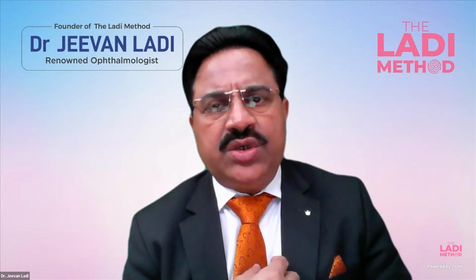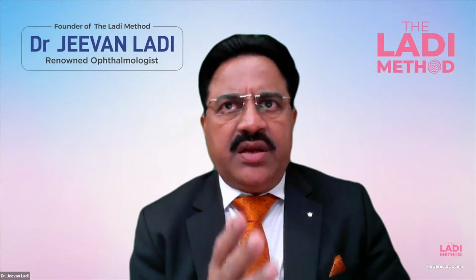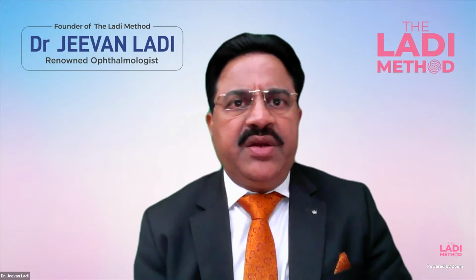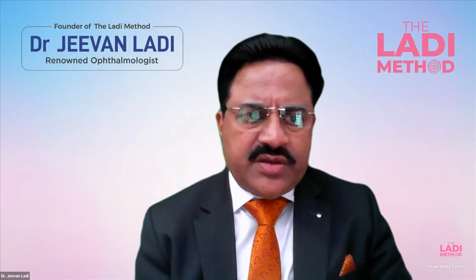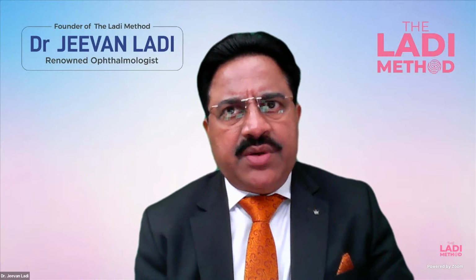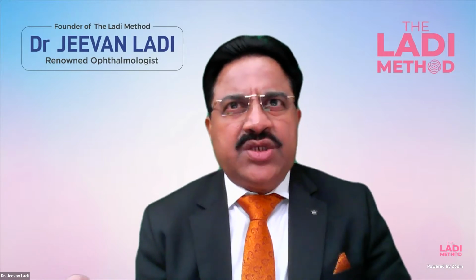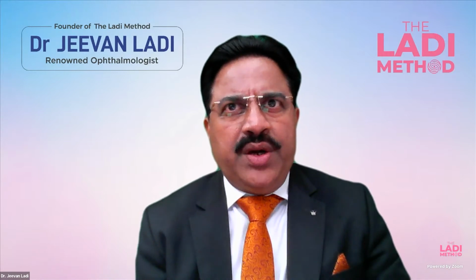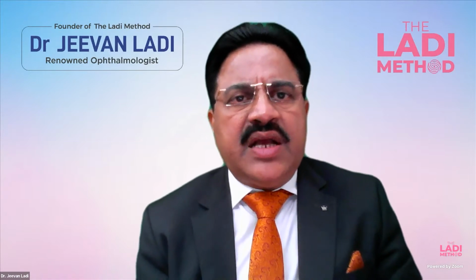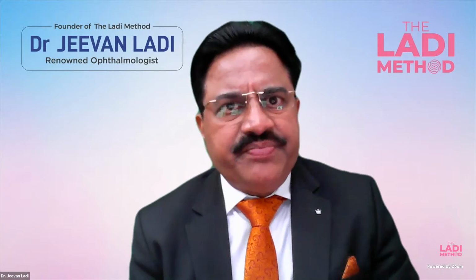The reason we are using topography is that it gives you more additional information, whether astigmatism is regular or not, and what else is happening to the anterior and posterior surface of the cornea. Though most of these Pentacams are giving the reading about the posterior corneal astigmatism, say anywhere between minus 0.1 to 0.9, they are not today considered, as far as science and academics are concerned, as more valid readings.